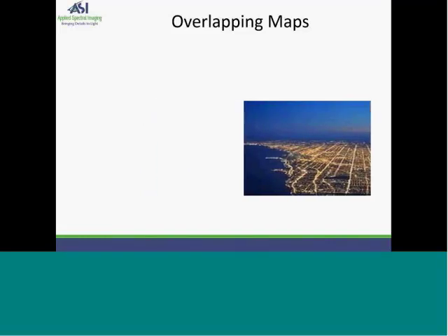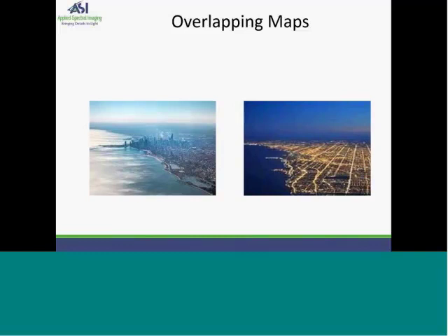But if I were to overlap a map of the city taken during the day, where the tallest building is very clearly seen, I could go back to the night image and confidently pinpoint the location of the tallest building.